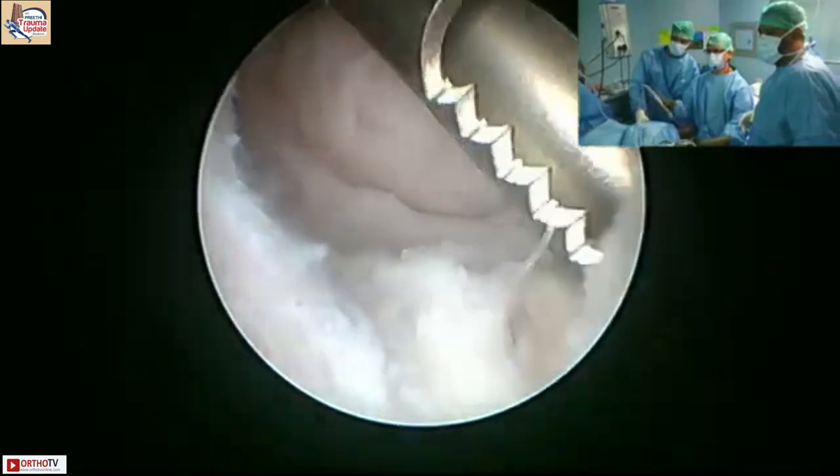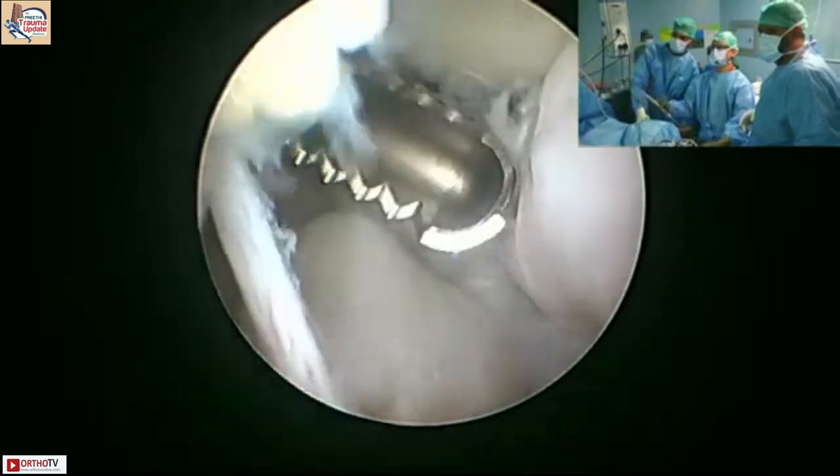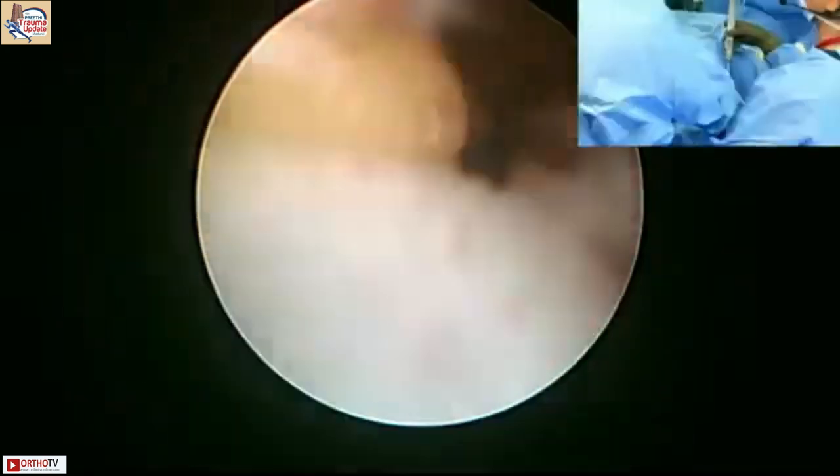The location of this loose body is in front of the radial head? No, it is in front of the coronoid. Okay. You see this? That is the coronoid. Yes. Yeah. That a loose body? That's a loose body. Yeah. No, that is the osteophyte of the coronoid. Okay.